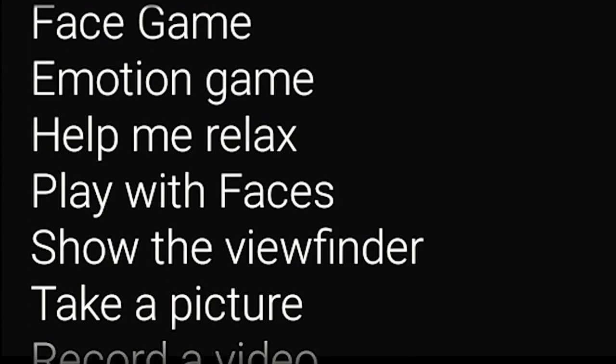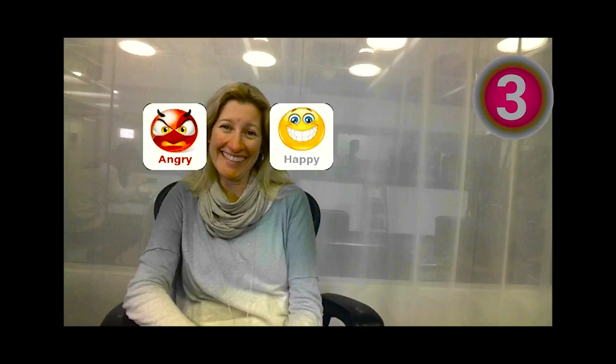First up, it's the emotion game. Will Sean be able to guess his mother's emotions? She smiles — he chooses happy with a head movement. Correct. You get a point, Sean. Now it's time for the second emotion. His mother is looking pretty neutral. Sean picks that option with a head movement. Nice job, Sean.